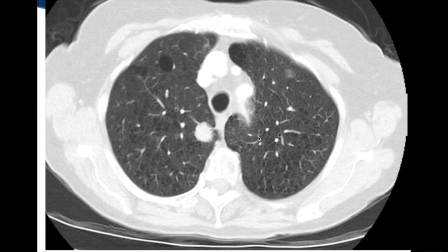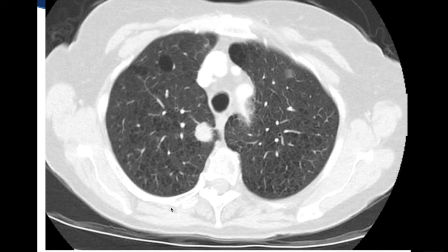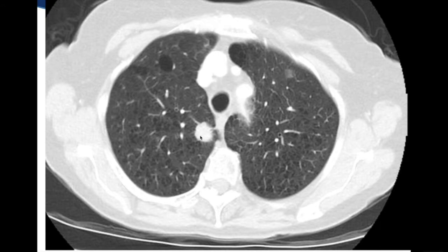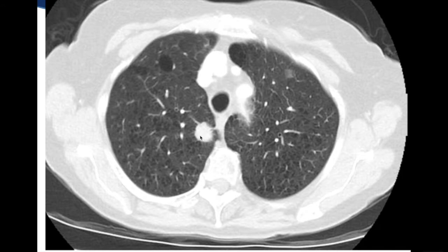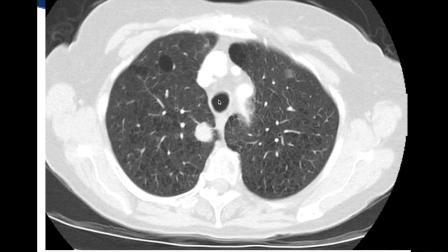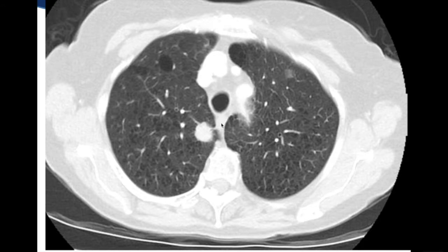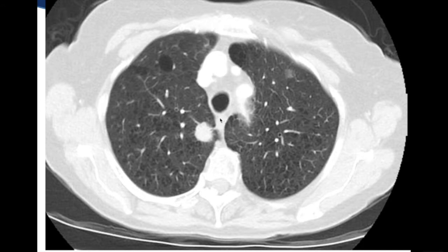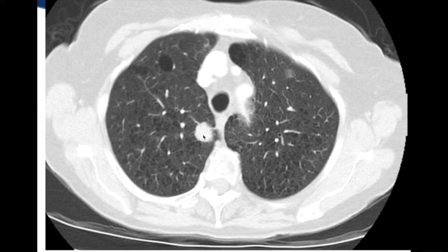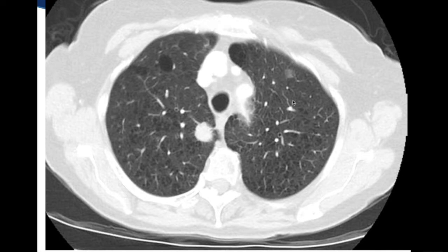Here's a tricky case — how are we going to get to this lesion? There's a background of emphysema so we don't want a CT-guided biopsy which would come through a lot of lung and put the patient at high risk of pneumothorax. It's not in contact with the trachea, but it is just in contact with the esophagus. This is a case I actually performed recently where the EBUS scope was put into the esophagus, pushed across just enough to needle that lesion, and it turned out to be an early-stage adenocarcinoma of the lung.